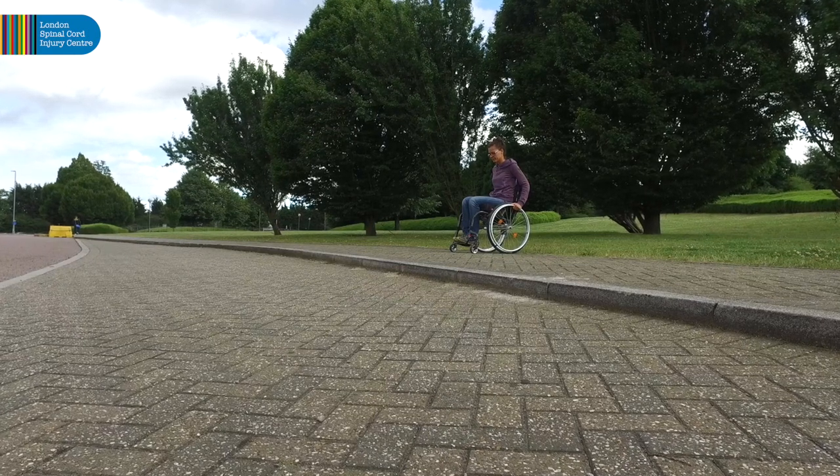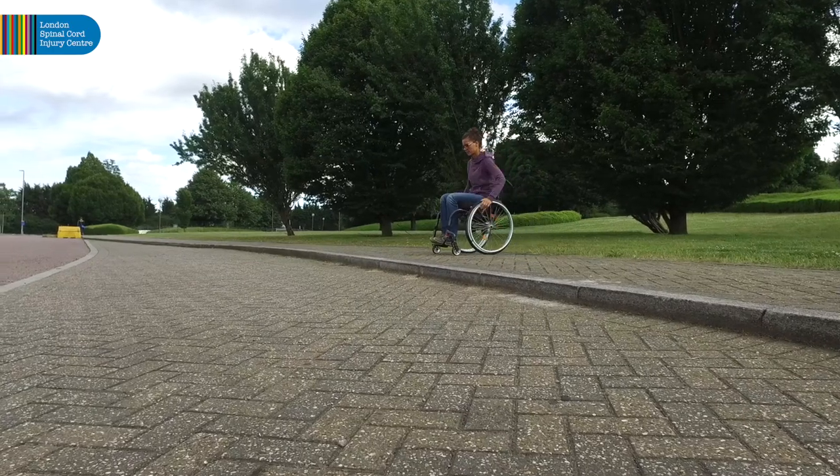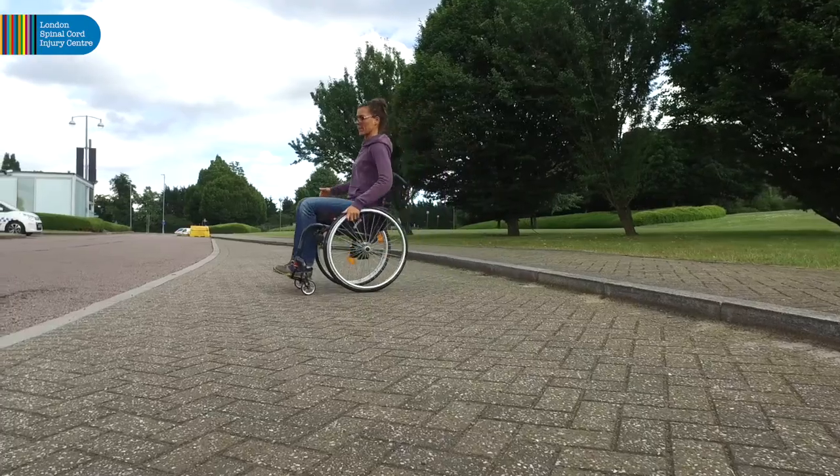Alternatively, at 12 inches from the kerb, perform a short push for forward momentum, then quickly perform another short push off the kerb to land on all four wheels.